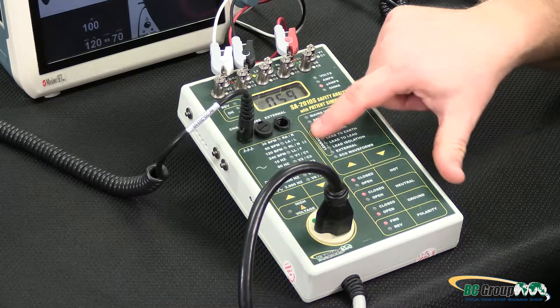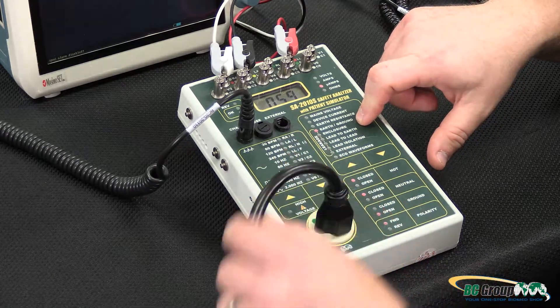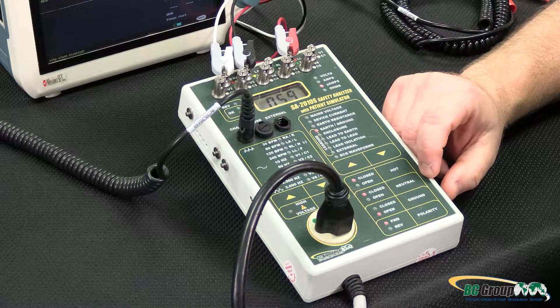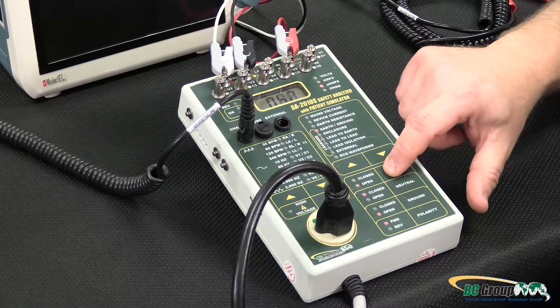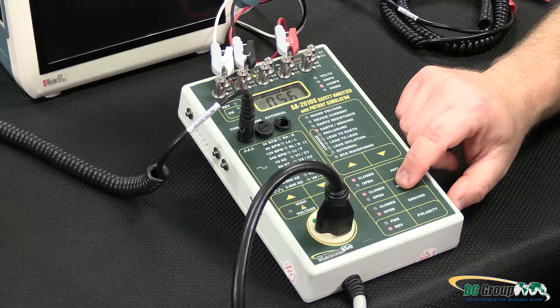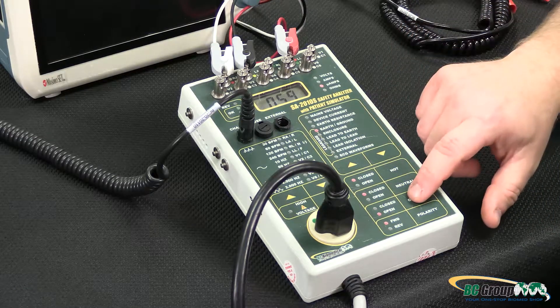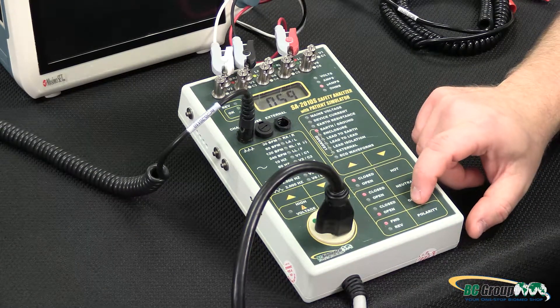Then we can move on to our leakage measurements. We'll start with earth ground leakage — this is measuring the current through the ground wire in the power cord. We need to test this with normal conditions; in this case we have 59 microamps measured. We also want to test under single faults: open neutral — we can see our current changes; open hot — our current changes; and with reverse polarity. Then again with open hot and open neutral in each combination. Since we're measuring the ground current, we force the ground to be open so our measurement circuit is in series with that ground — we can't close it in this mode, and that's normal.